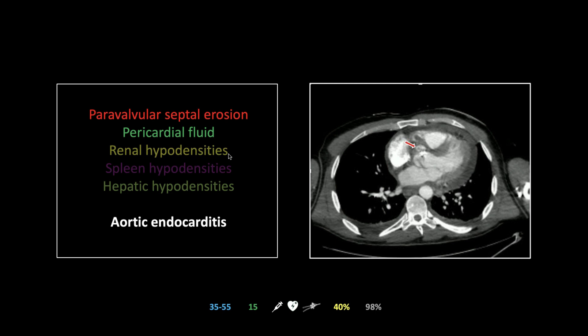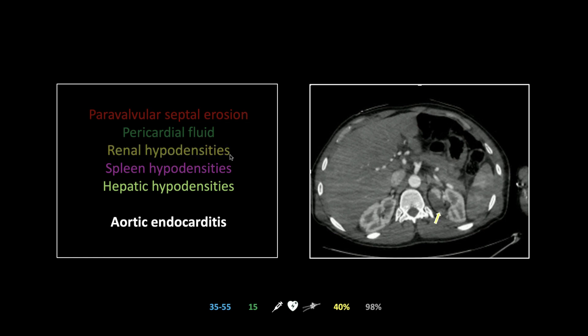This is a ring abscess adjacent to the aortic valve ring. When presenting this live, I always ask the crowd how these patients present — they present with heart block, because the AV node sits right where that infection is eroding. There is also hypodense pericardial fluid, which in this case is almost certainly piopericardium, and wedge-shaped hypodensities in the kidneys and spleen — classic peripheral wedge-shaped hypodensities.